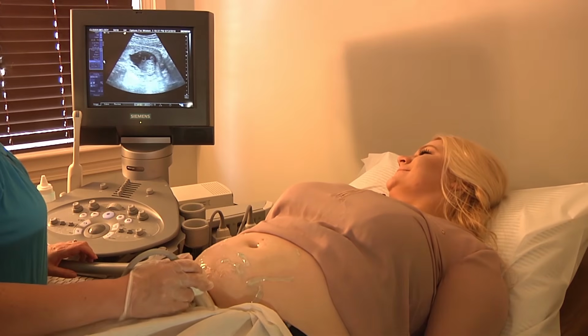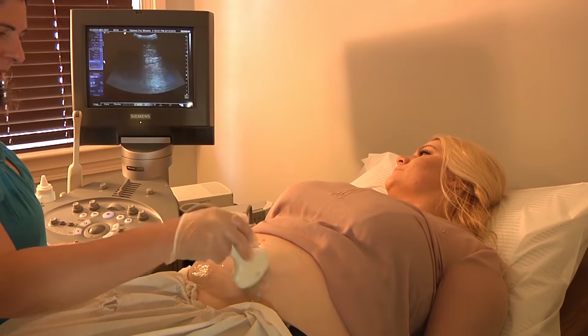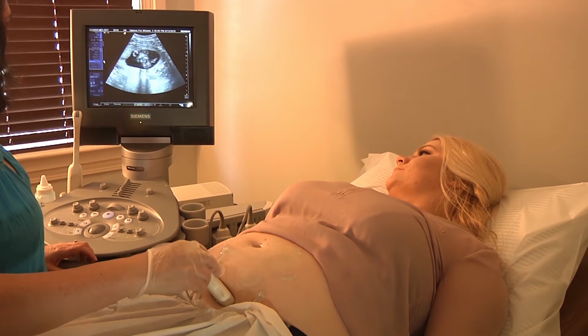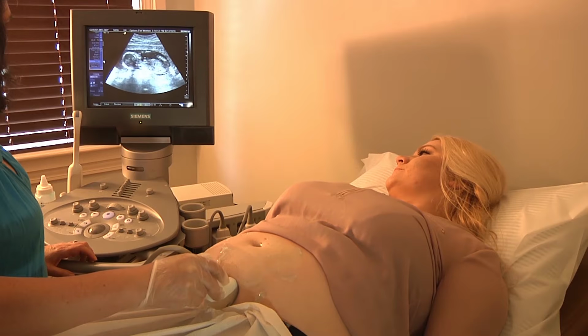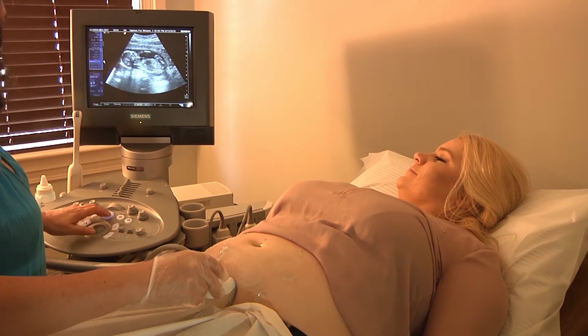Okay, now you've got to find the lie of the baby. Let me get back. Alright, so I'm on something. Just on something. Good. And she's rocking and turning, and she's stretching the baby out. Whoa, there she goes. How's this baby lying?